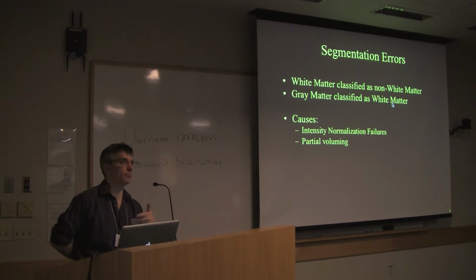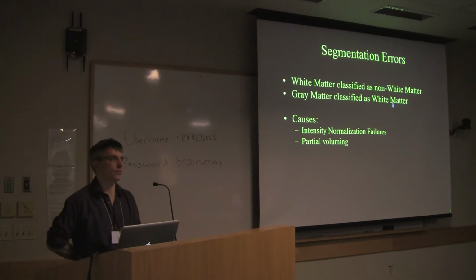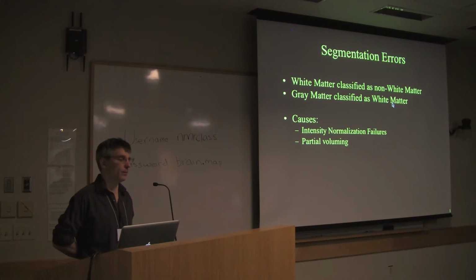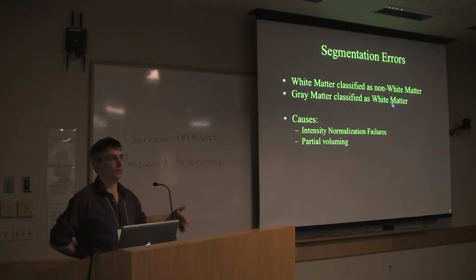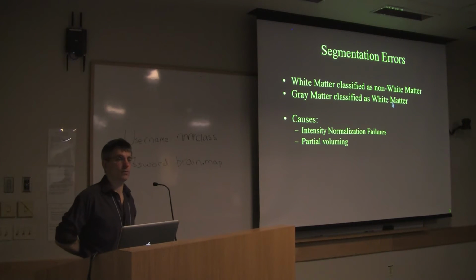However, most of the time, FreeSurfer does a pretty good job, and then there'll be a few subjects that will have these skull strip errors. And in that case, probably you would just want to use the default parameters inside of FreeSurfer. Otherwise, these are the parameters that everybody is using, so they have a lot of mileage on them, and so you can have more confidence, I think, rather than changing your own thresholds. But if you're constantly seeing some error, then it might be better to change the threshold for a group of subjects.